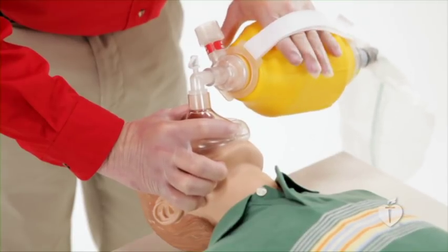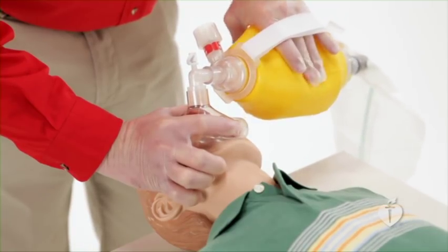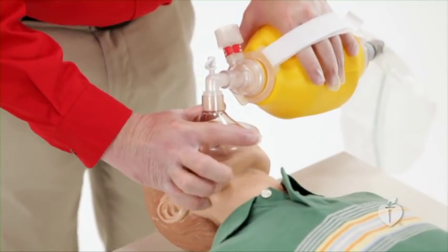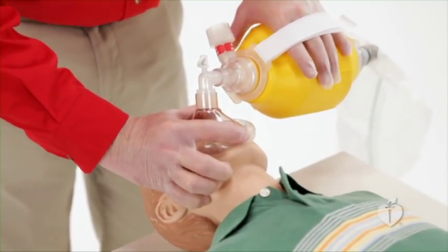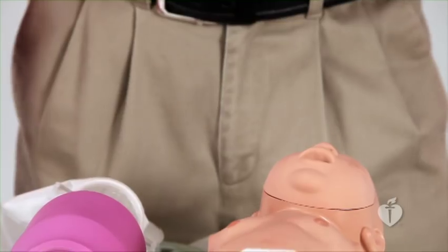Deliver each breath over 1 second. If the chest doesn't rise, then you are not providing adequate breaths. Adjust the mask, reposition the head and neck, or administer a larger amount of air. On an infant mannequin in the practice station, the technique looks like this.